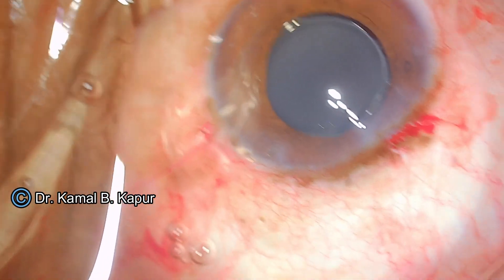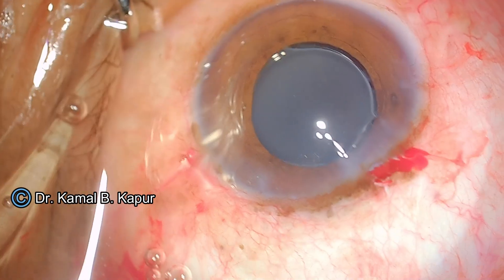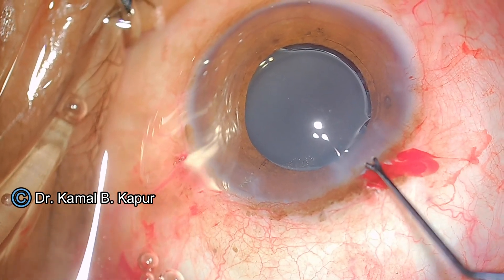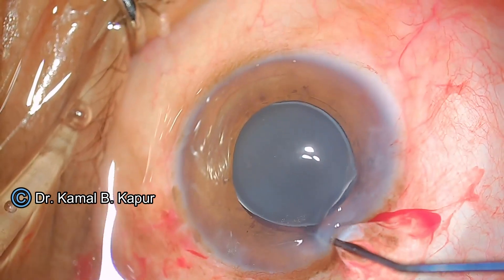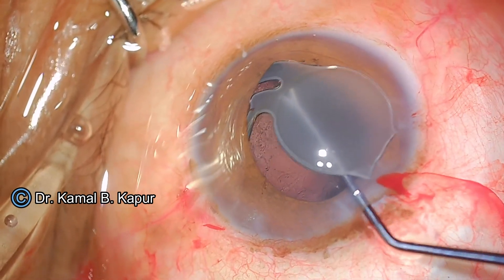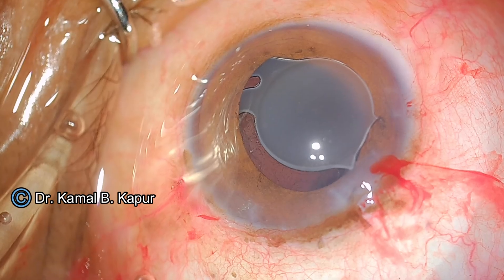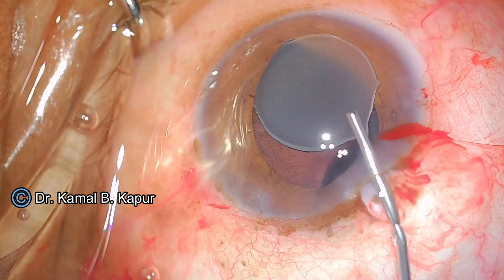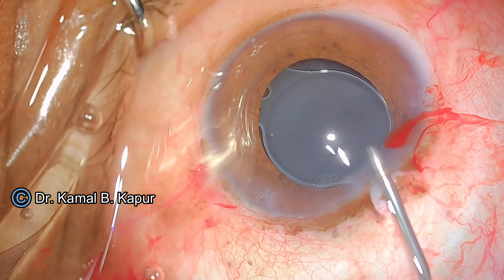The trick is getting the cutter fixed in place, capturing the IOL in its teeth, and pulling your left hand towards the cutter while only slightly advancing the cutter forward — this keeps you away from the endothelium and the posterior capsule. Now I have cut the haptic away. You need to be very careful: the cut edges of the IOL are very sharp and can damage the endothelium and also cut the posterior capsule.